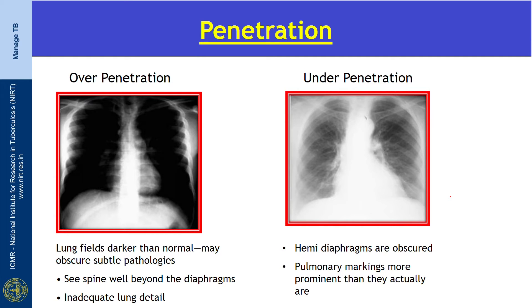This is an under-penetrated film. Here the hemidiaphragms are obscured and pulmonary markings are more prominent than they actually are, which leads to over-diagnosis.